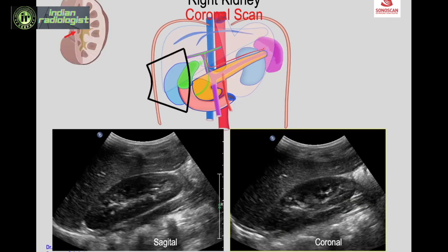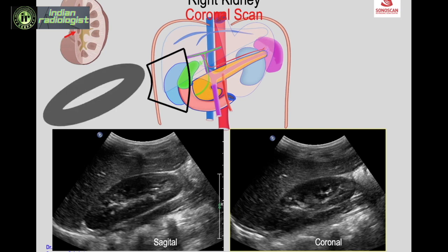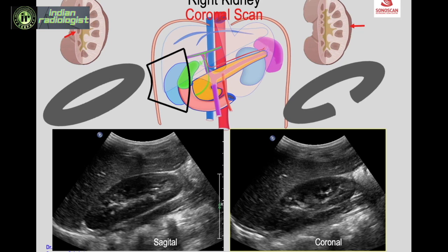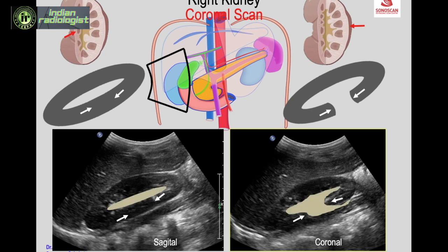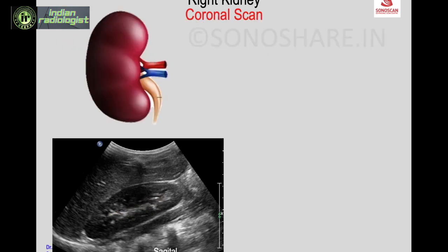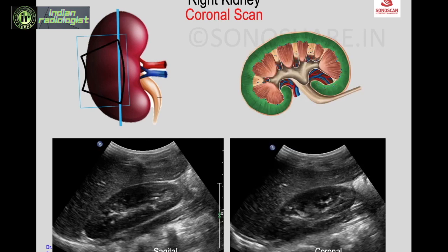Comparing sagittal and coronal scans: in the sagittal section the parenchyma is seen all around. In the coronal scan there is a discontinuity in the medial aspect because of the escape of the vascular pedicle — a discontinuity of the parenchyma medially — so you see the central echogenic area continuous with the perinephric fat or retroperitoneal fat at the hilum. In the sagittal section the kidney shows parenchyma all around, whereas in the coronal scan the parenchyma is all around except at the renal hilum.